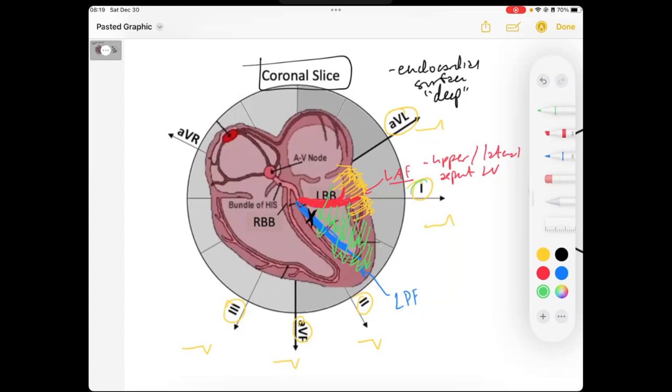Well, we look at our lateral leads, lead 1, AVL. These signals are going away from those leads. And this is a strong signal. So we're going to get deep S waves as a part of our QRS.